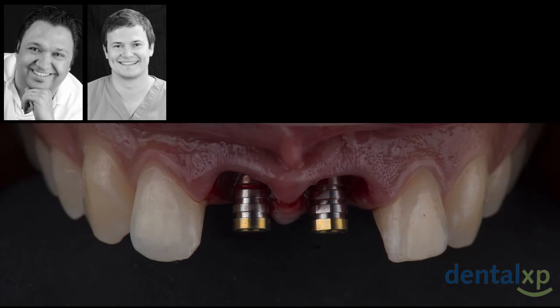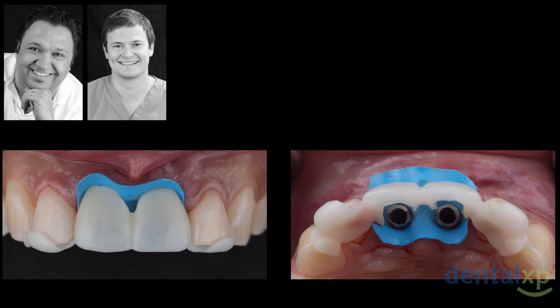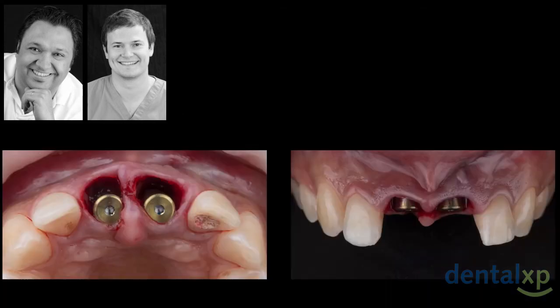We place our two temporary abutments, occlusal view, and we try on our temp shell. And you can see here we trimmed a little bit the palatal part because it was difficult to fit it correctly here. And we are going to add acrylic to that to capture the temp shell with our abutments. And we are ready in the lab to prepare our temporaries.